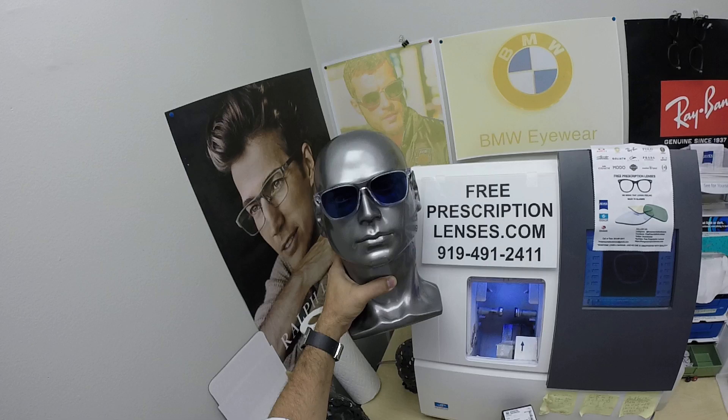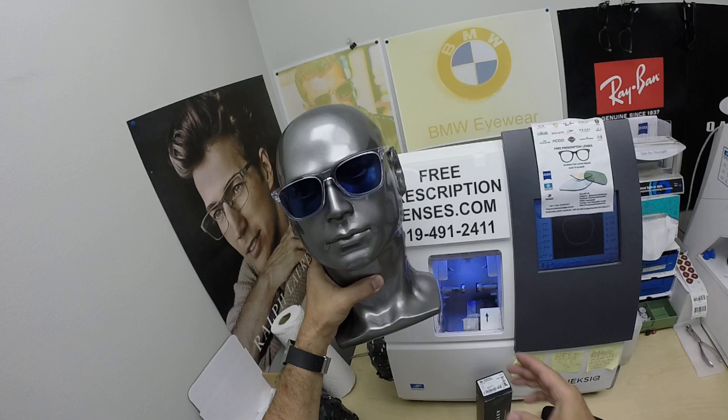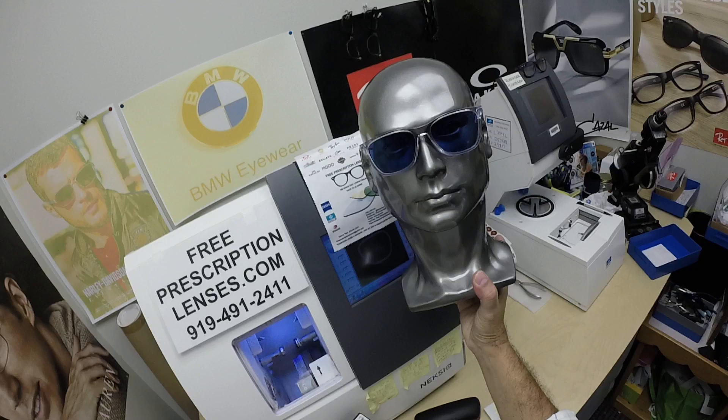They're also temperature sensitive, meaning they will get darker when it's 85 degrees and below, and they won't perform as well when it's 95 and above. When it's 100 degrees outside, you're miserable, they're miserable — nobody works 100% when it's 100 degrees outside. We all work much better when it cools off. It's 72 degrees in my lab, so that's what they look like at 72 degrees.